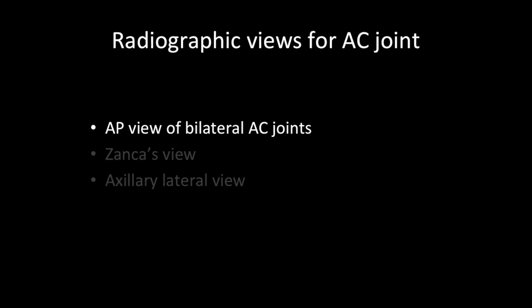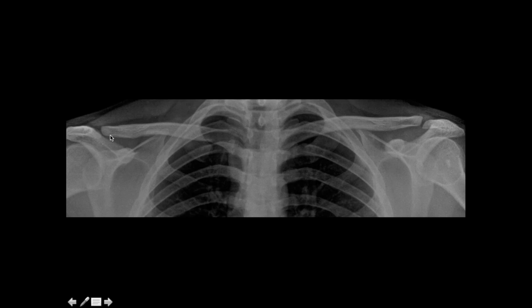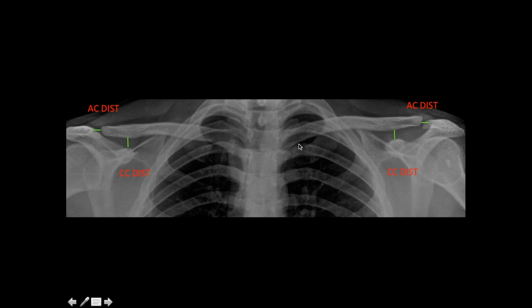The first radiographic view is the AP view of bilateral AC joints, which is useful for comparing the coracoclavicular distance on the injured side with the normal side. Normally the CC distance is the same bilaterally. If it is increased on the injured side, it indicates AC joint injury. Similarly, widening of the AC distance on one side indicates AC joint injury on that side.